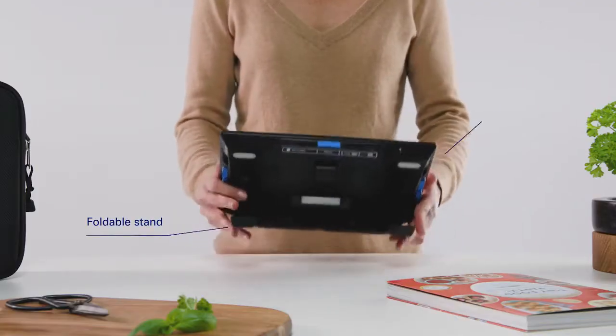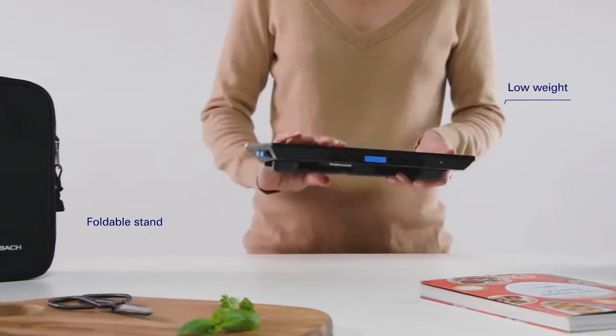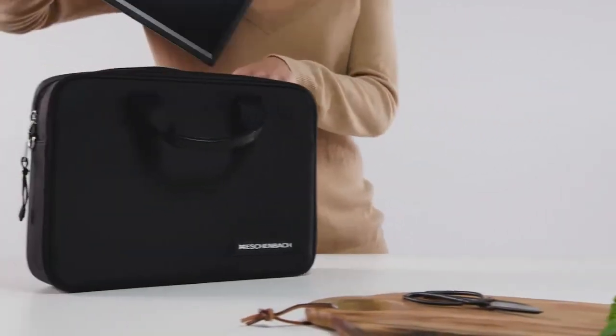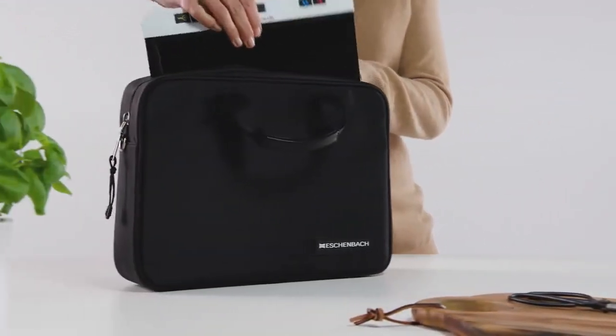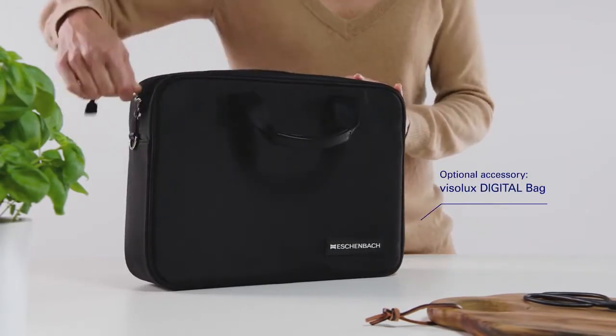Thanks to its compact shape and low weight of just 2.2 pounds, the Visolux Digital XL FHD is easy to transport.